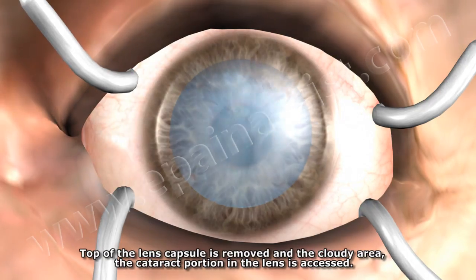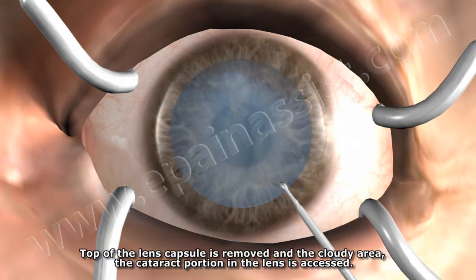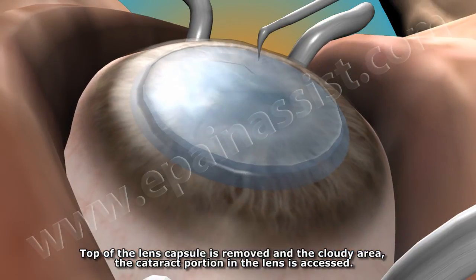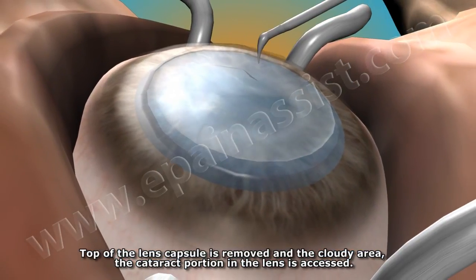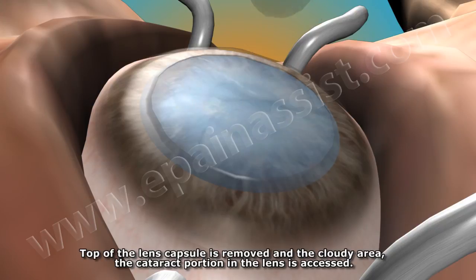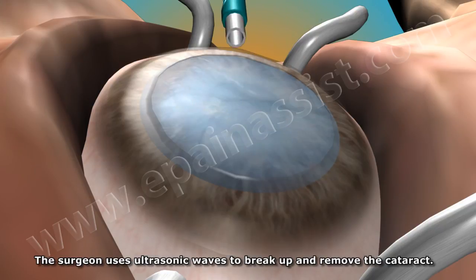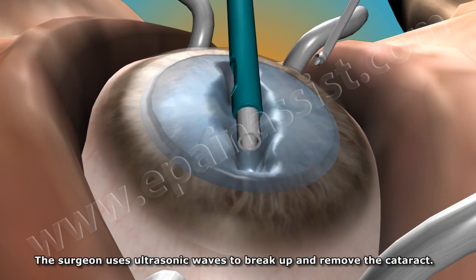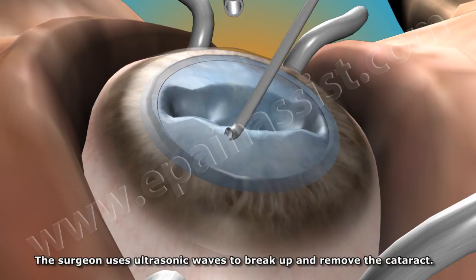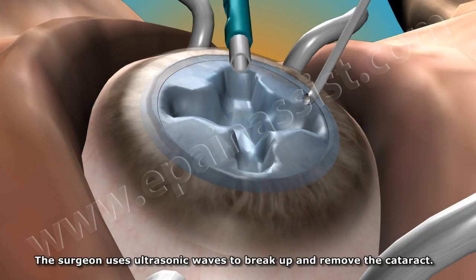The top of the lens capsule is removed and the cloudy area — the cataract portion in the lens — is accessed. The surgeon uses ultrasonic waves to break up and remove the cataract.